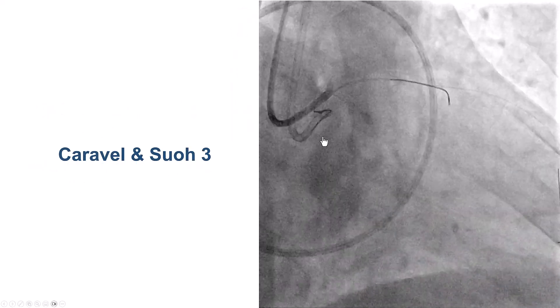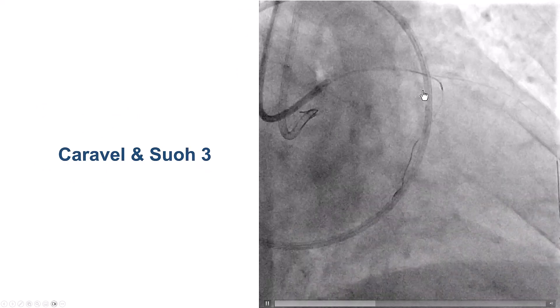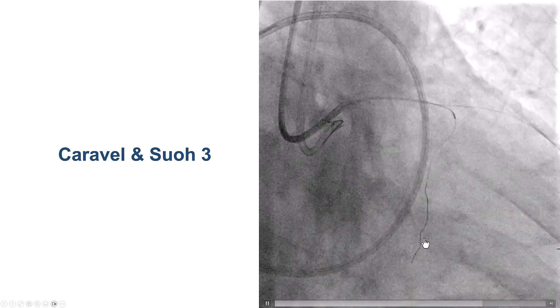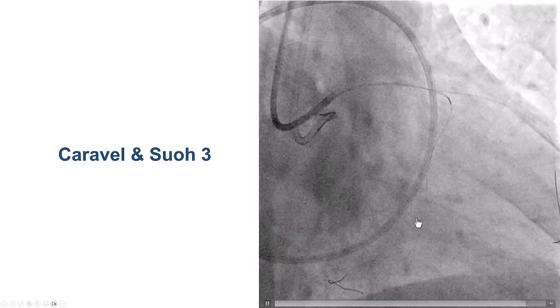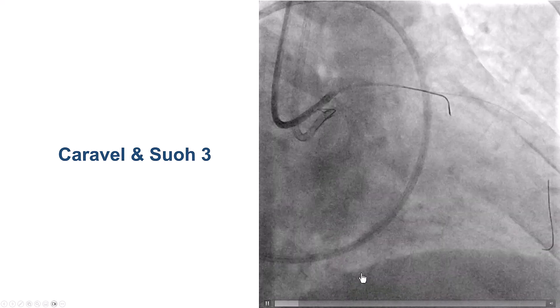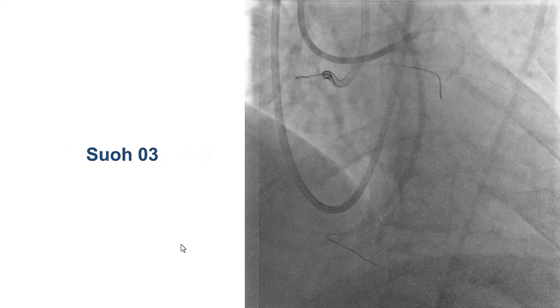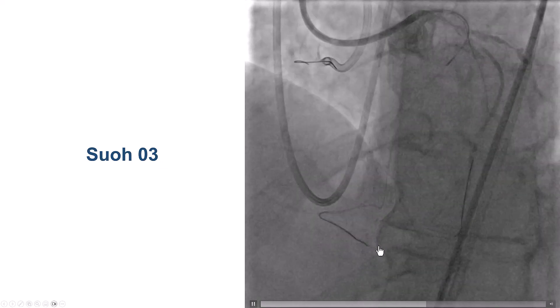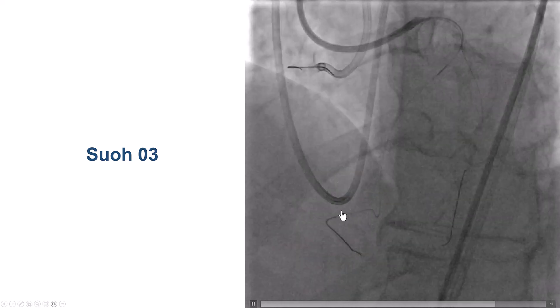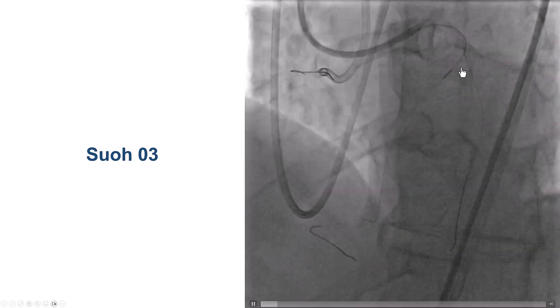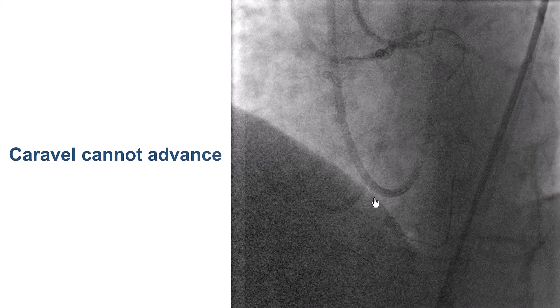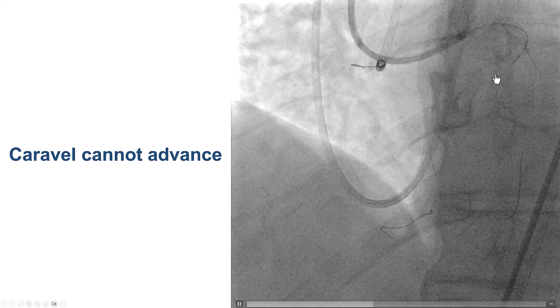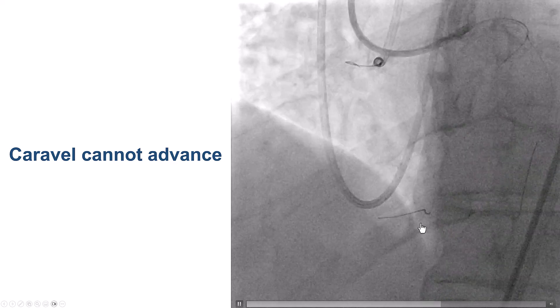We switched to the retrograde approach using an EBU guide with a Caravel microcatheter. We used a Suoh 03 guidewire, which did cross and advanced down the PDA. We confirmed true lumen position by injection from the left. The next step was to deliver the microcatheter to the distal vessel, but unfortunately we could not advance the Caravel — a low-profile microcatheter — distally.